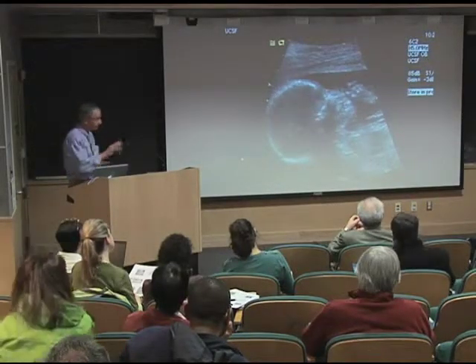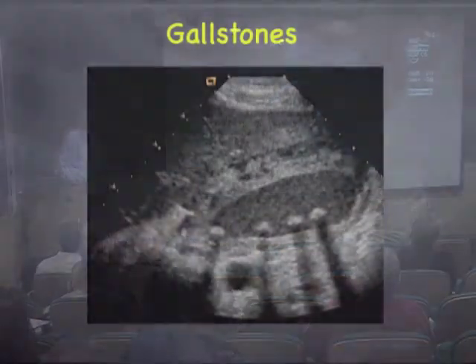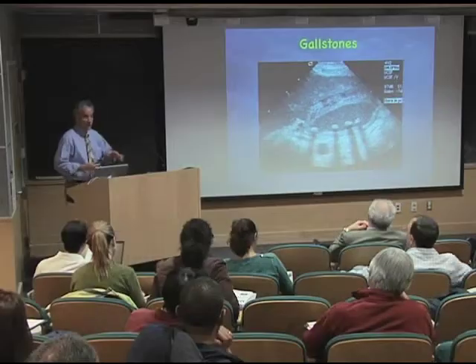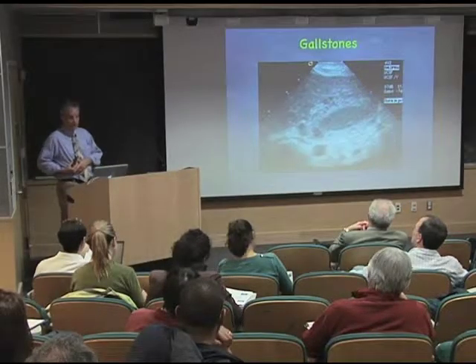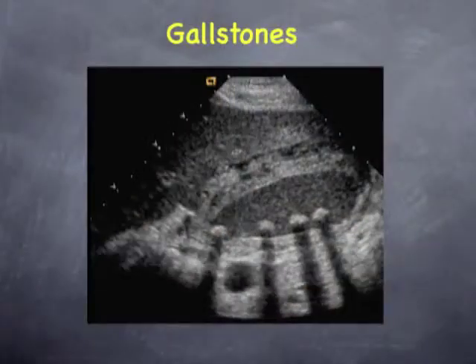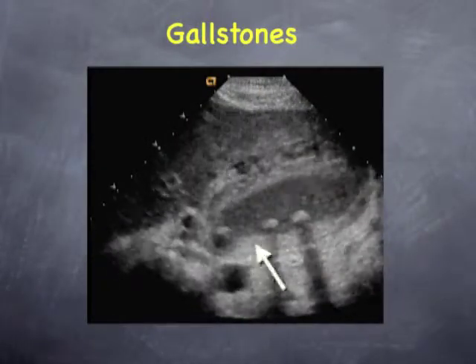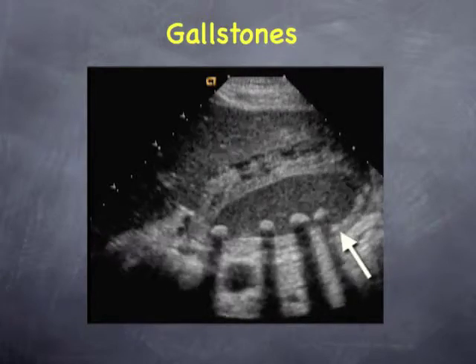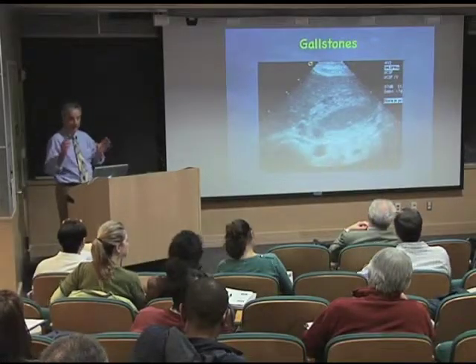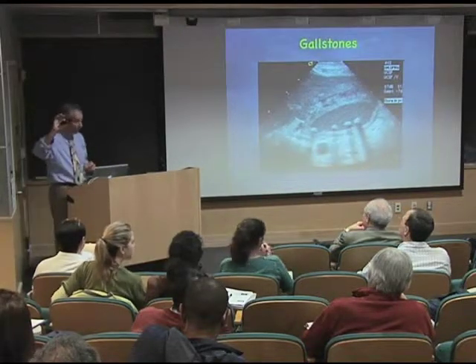Here's a patient that came into the emergency room because they had severe right upper quadrant pain after eating. Sure enough, when we do the ultrasound, we can see there are gallstones in the gallbladder and the gallbladder wall is markedly thickened. One of the beauties of ultrasound is that the probe is about the size of this little pointer.